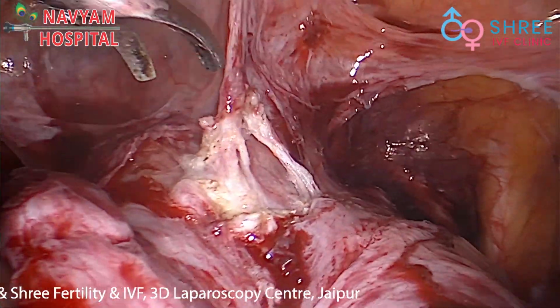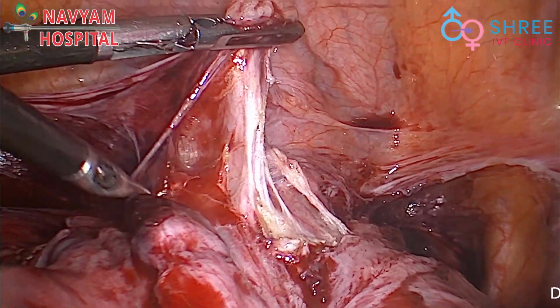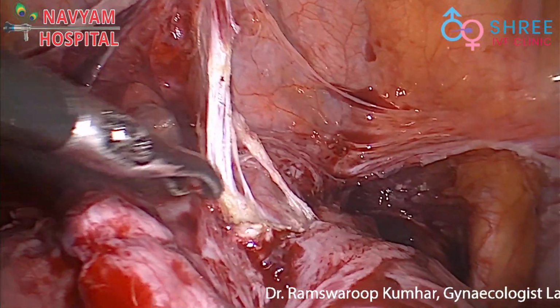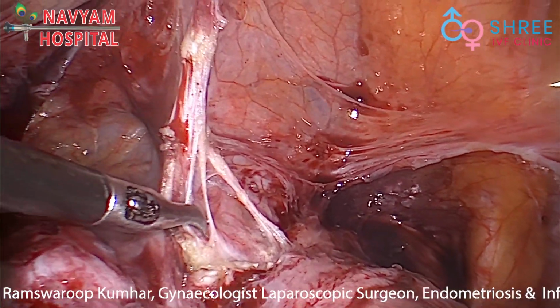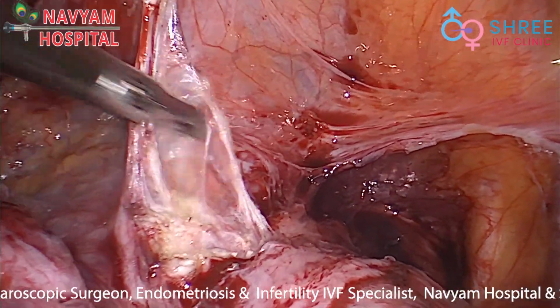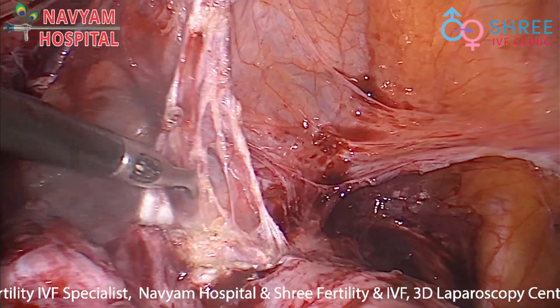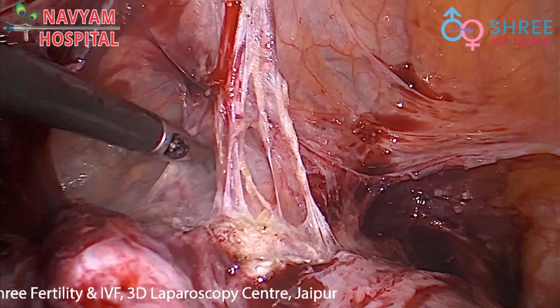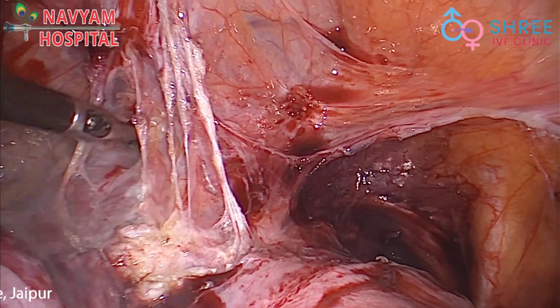The key of the bladder dissection for previously operated bladders: we should hold the whole bladder anteriorly and give traction to the uterus posteriorly, and the CO2 gas itself will provide us a proper plane to dissect the bladder down. Here we can see very few sharp cuts are made, otherwise the bladder is dissected deep down by blunt traction only.